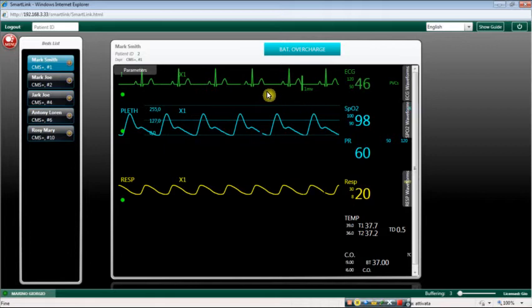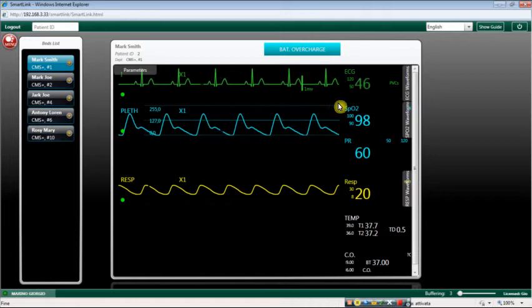Waveforms are displayed beside the corresponding parameters. All waveforms related to a parameter are kept together.